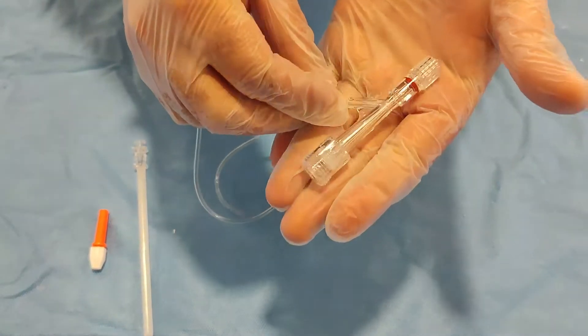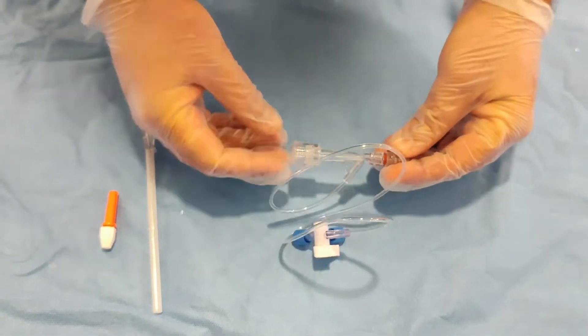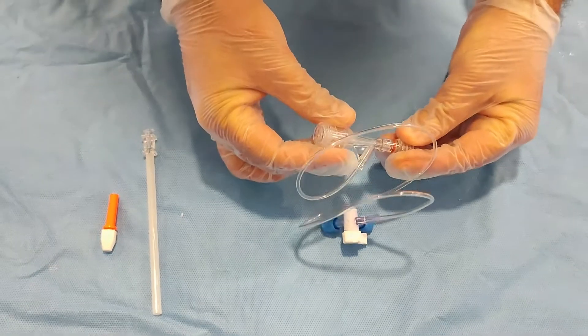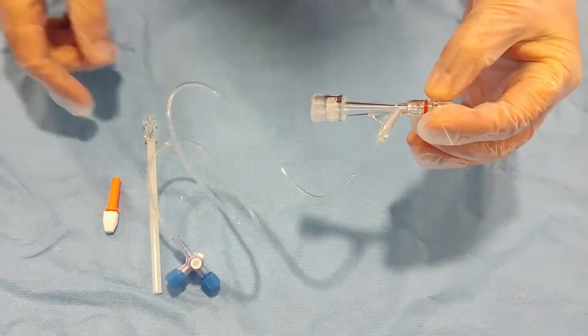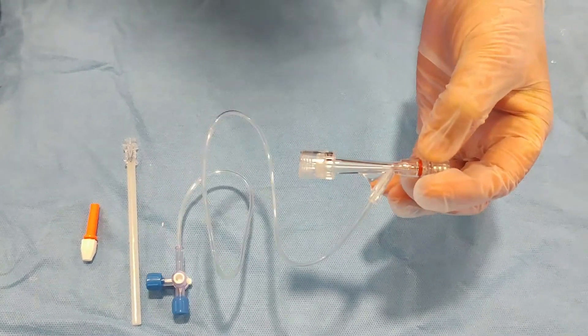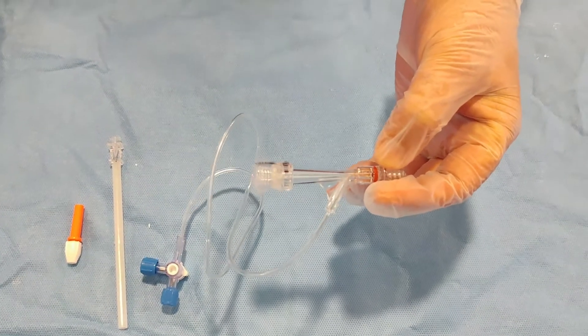Have a look. So this side goes to the catheter, to the patient, and this side towards the operator or the doctor. Why is this called the y-connector or the anti-bleed? Because this one can be used for multi-purpose.